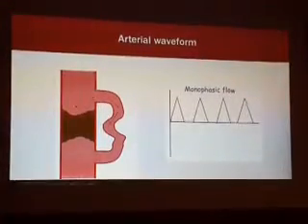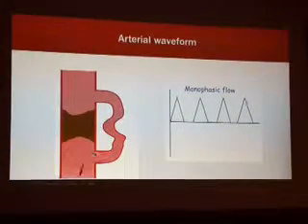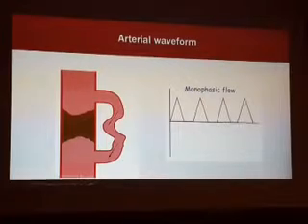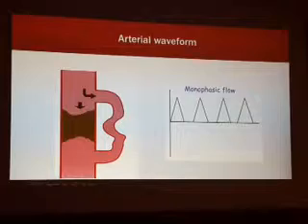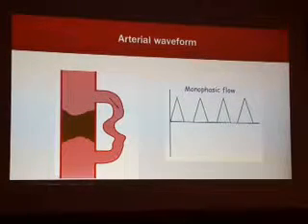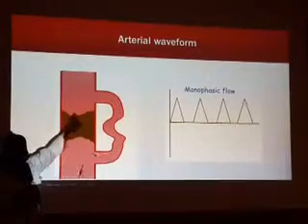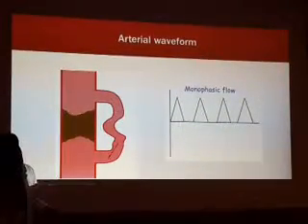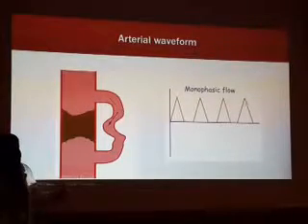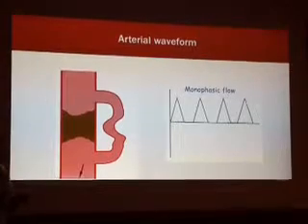The spectral waveform, it will be normal and no more normal. So when you have a stenosis, you have to document it, and when you have occlusion, you have to document what? Collaterals. When you have an occlusion, لازم احنا looking for collaterals. لأنه مستحيل يمشي معاك الارتري أو الفلو without another passage. إذا هو صار عندك هنا occlusion في SFA، بس أنت لاقي البوبليتيال artery ماشي، how come؟ ما حيمشي إلا من collaterals. فهذا يعتمد proving your case.